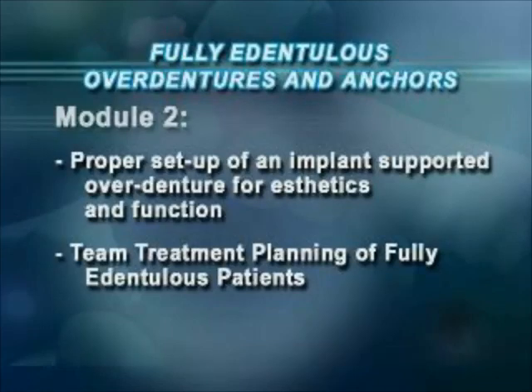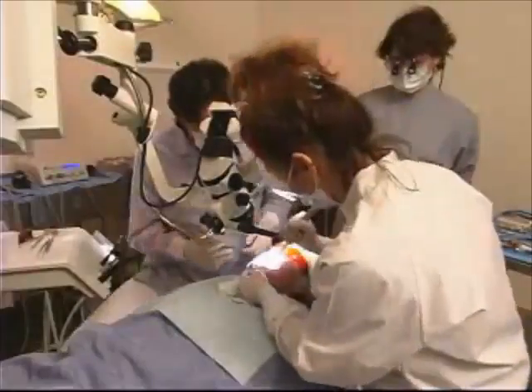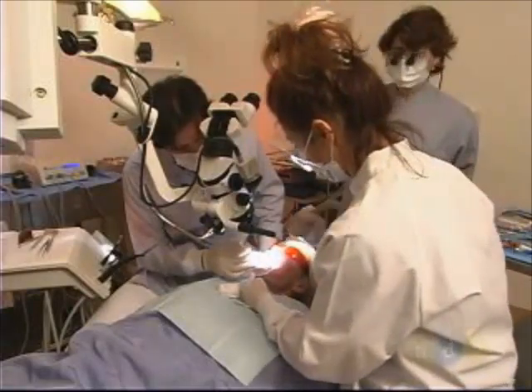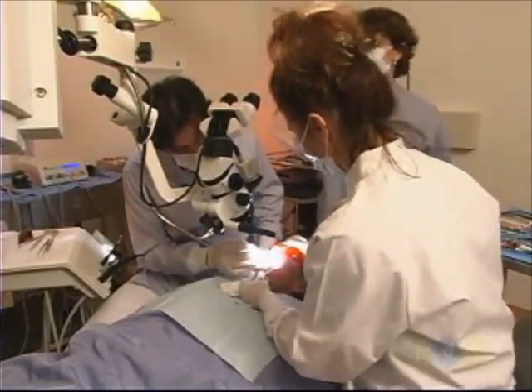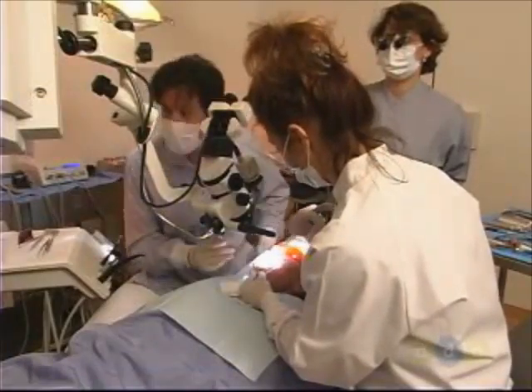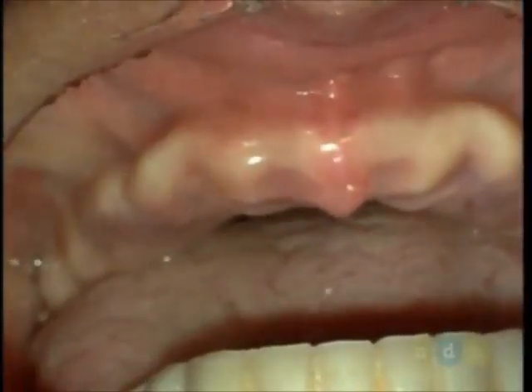of fully edentulous patients. What we're going to do today on this nice lady, with the help of my partner here, my prosthodontic specialist, Dr. Maha El Said, we're going to go ahead and we've taken teeth out that were hopeless in the maxillary arch.